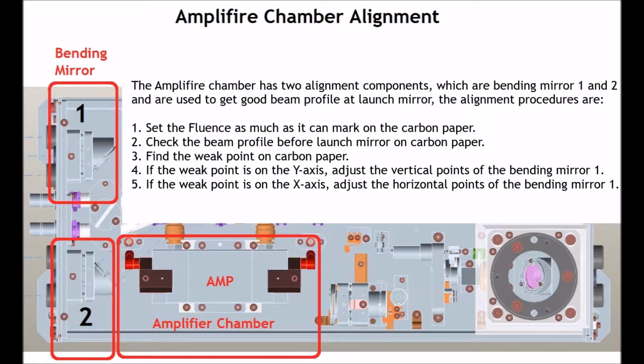The amplifier chamber has two alignment components, which are bending mirror 1 and 2, and are used to get good beam profile at launch mirror. The alignment procedures are: 1. Set the fluence as much as it can mark on the carbon paper. 2. Check the beam profile before launch mirror on carbon paper. 3. Find the weak point on carbon paper.